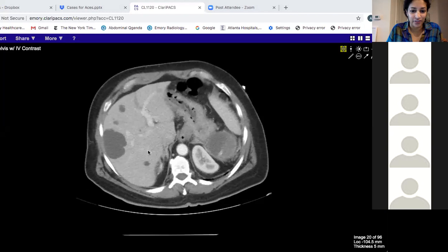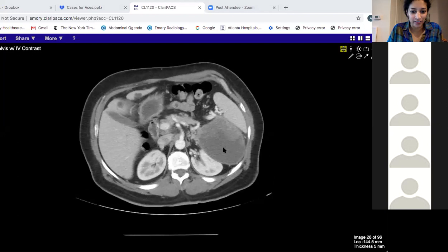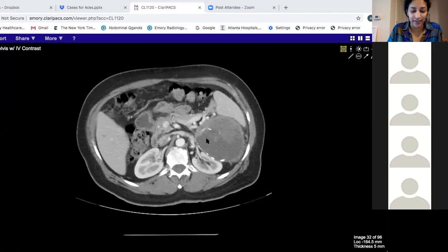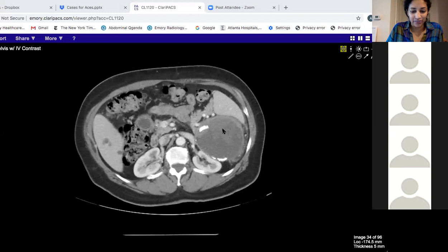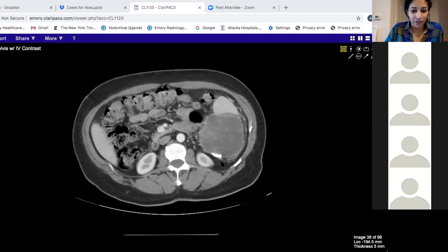This is the first case. Ignore the liver — there are just some cysts there. You can see there is a mass in the left upper quadrant. It's mostly cystic but seemed to have complex components including calcifications. We weren't sure where this mass was coming from. It didn't look like it was definitely coming from the colon, not definitely from the spleen. There was no claw sign with the kidney. We thought maybe this is a distal pancreatic mass like a mucinous cystic neoplasm or a SPEN tumor, but the pancreas is actually over here and it's normal.